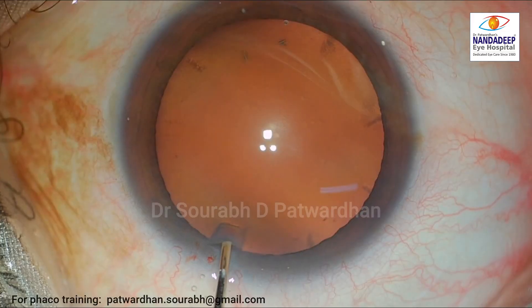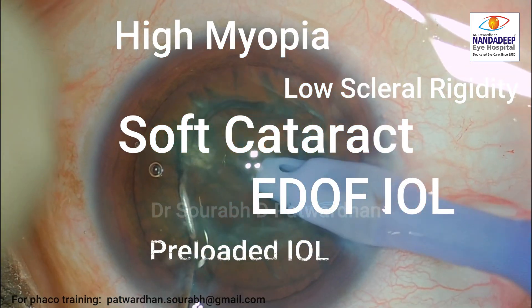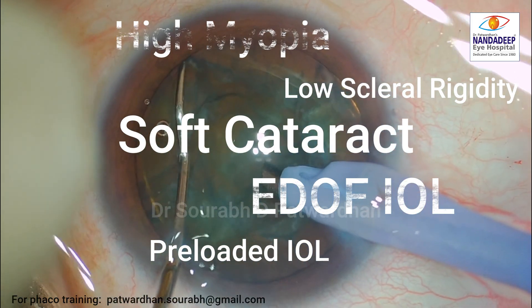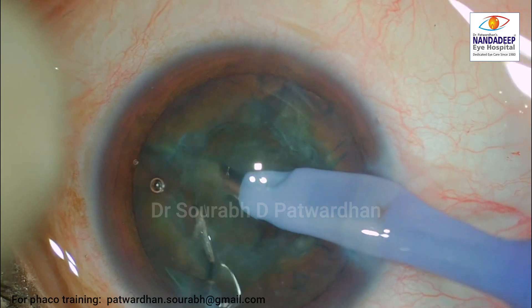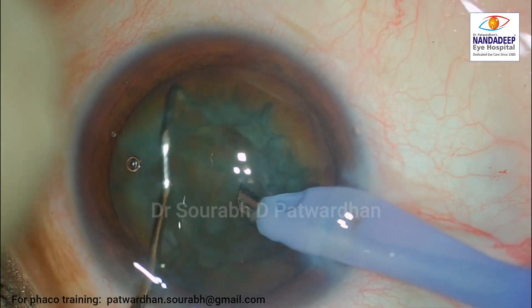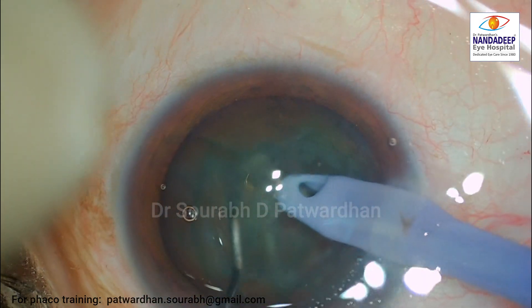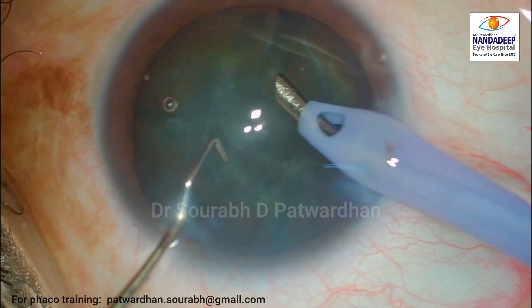Let's see how the case proceeds. I already planned for the surgery — the patient has high myopia and a soft cataract. I am planning an EDOF IOL which is a semi-preloaded IOL. I start off the case with some mechanical chopping using Patwardhan's hybrid chopper for the soft cataract, and the case is going as per the plan.